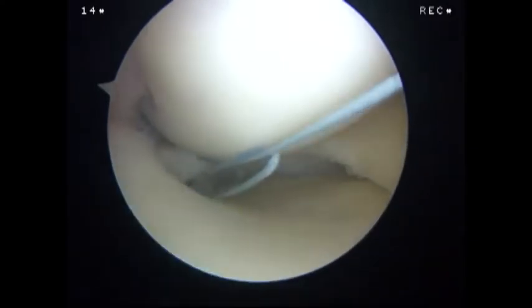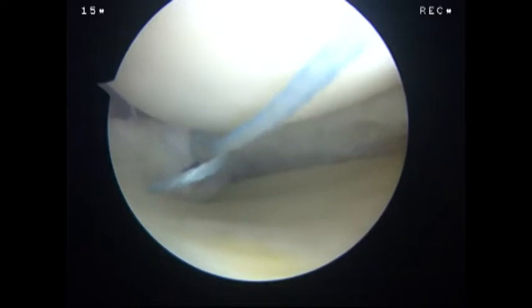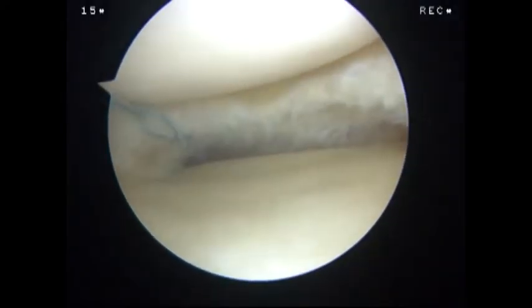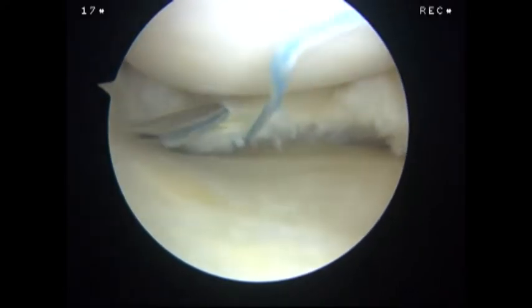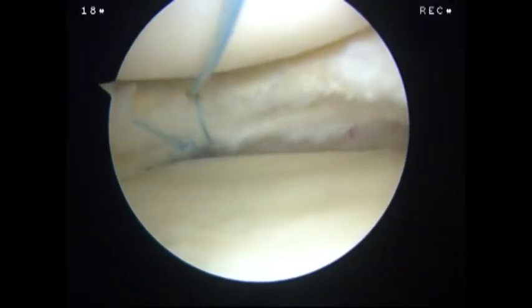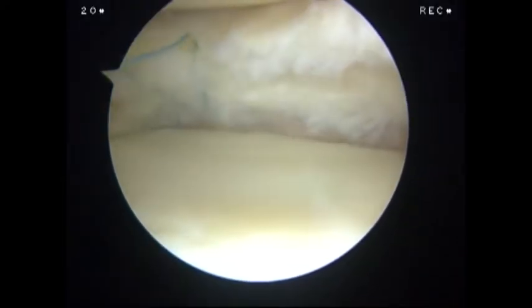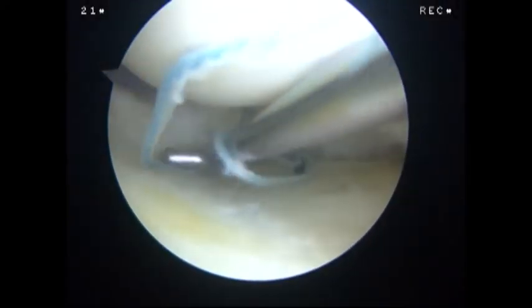On the next step, we pull the free end of the stitch, which is passed through the spinal needle. After that, we tighten the stitch. We repeat this maneuver several times until we create a stable, continuous W-shaped configuration of overlocking stitches.